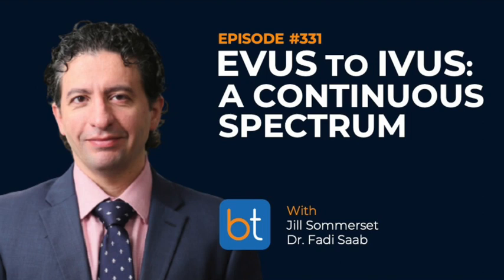Jill, how about you? What do you think about using IVUS for almost every case on the arterial side? I'm in an environment now where I see it used throughout all the cases, and it certainly makes sense. I feel like extravascular ultrasound, EVUS, can be such a nice complement to IVUS. It drives Dr. Montero Baker crazy when we talk about limiting dissections, and put the ultrasound probe up there and see if it's flow limiting. Do we have a waveform change, or is it non-flow limiting? There's a lot of valuable information we can get from EVUS when we see a dissection on IVUS. So I think they're very complementary.